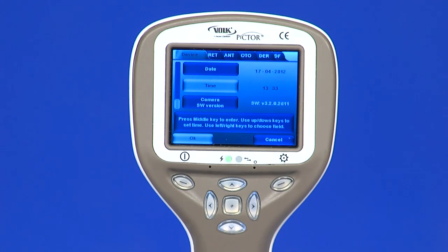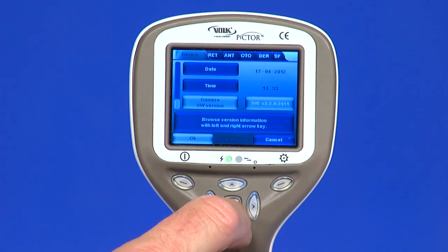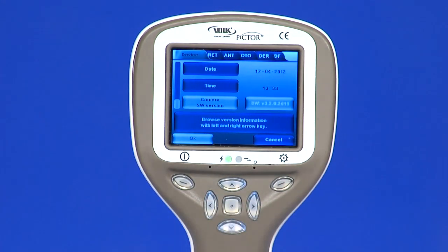Camera SW version: this item in the device menu provides the camera software version.